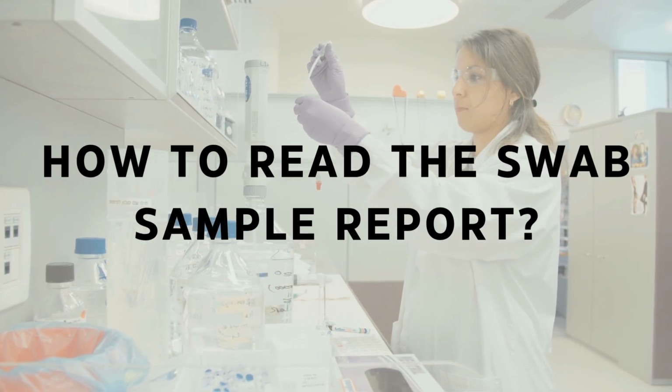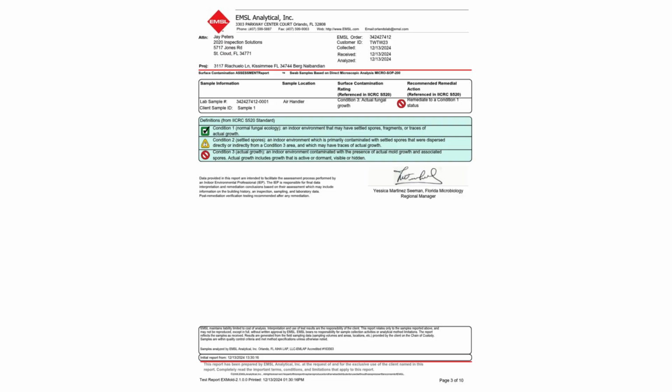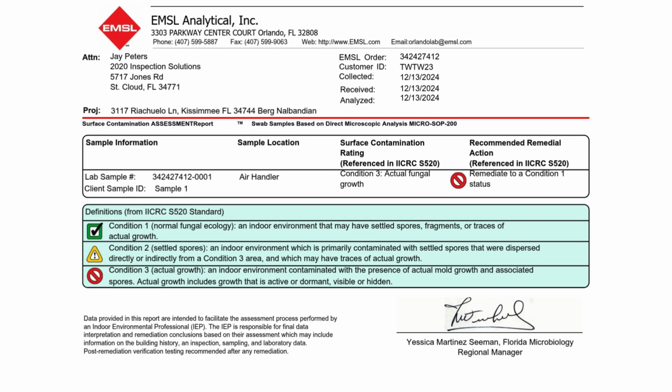Swab results. The part you'll want to pay the most attention to is on page 3, that's where the real information lives. This will tell you the surface contamination rating. This will be labeled as either Condition 1, normal fungal ecology, no growth. Condition 2, settled spores, mold spores present, but not actively growing. Condition 3, actual fungal growth, active or past mold growth. In this case, the condition is level 3, which means actual fungal growth.